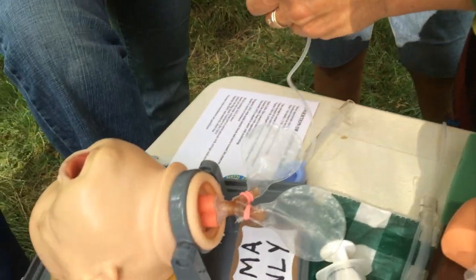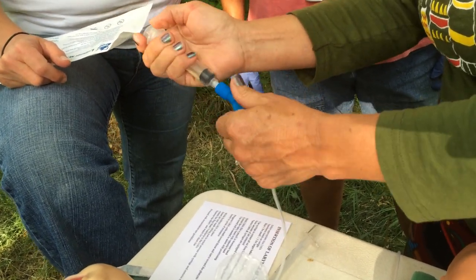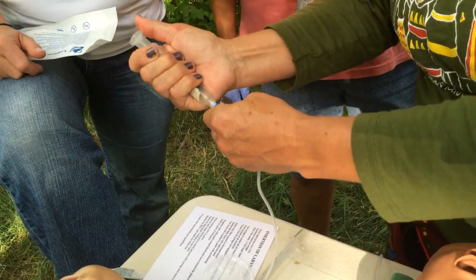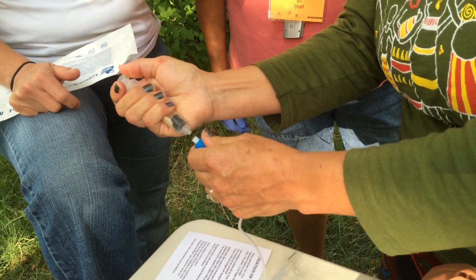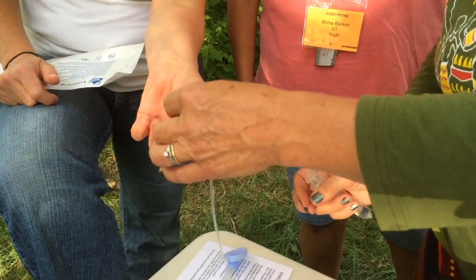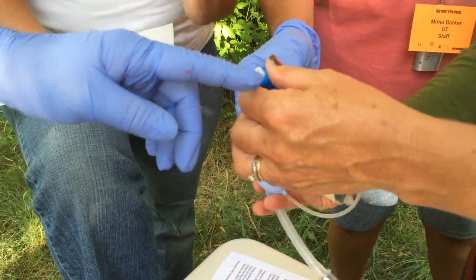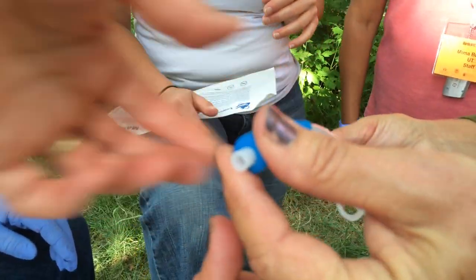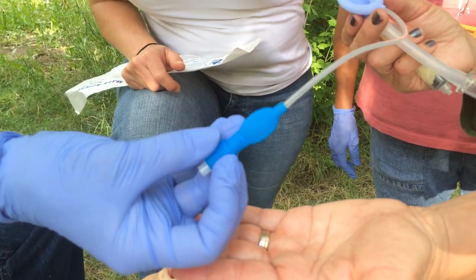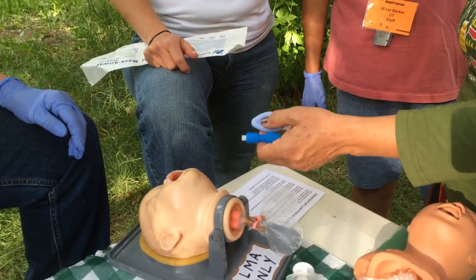I just wanted to know if there was some other gauge to utilize. It's mushy. That's my term. Mushy, but not flat and not hard. So that's why I wanted you to show me exactly what the right consistency is, so you can feel it. That's too full. Yeah, you can tell. If you were to fill it that full when it was in there, you would see it come out.